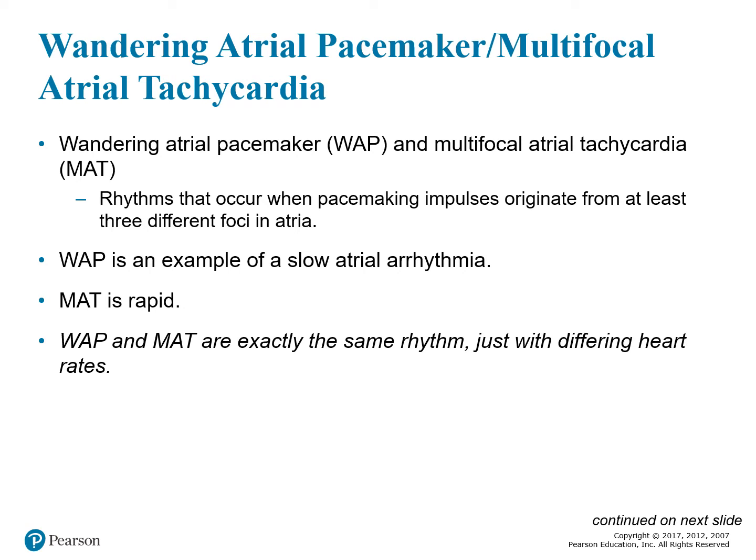In a MAT, multiple ectopic sites stimulate the atria. Sometimes it can be confused with an atrial fibrillation because both rhythms are irregular. However, P waves, although varying in size, shape, and direction, are clearly visible in a MAT versus in a fibrillation.